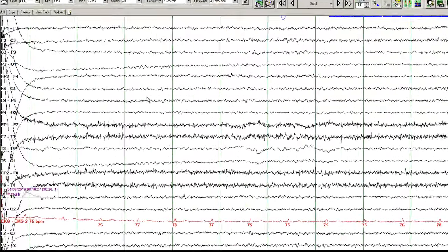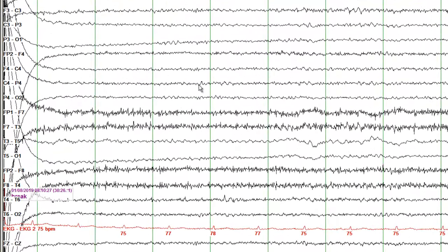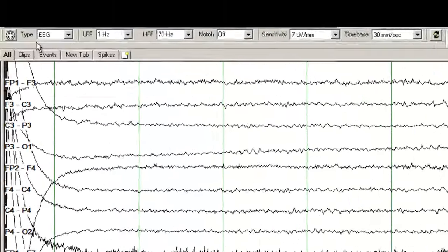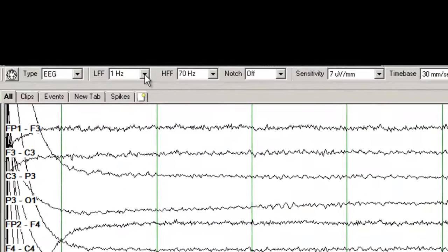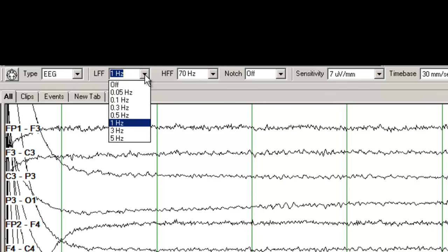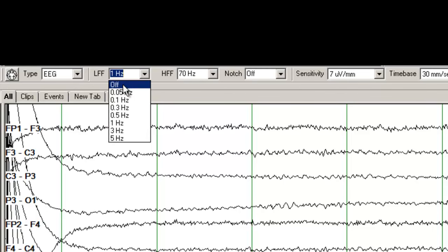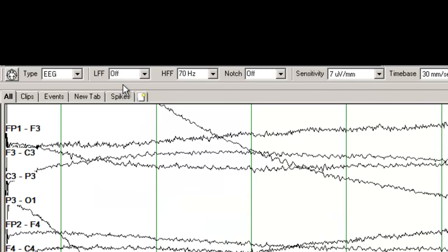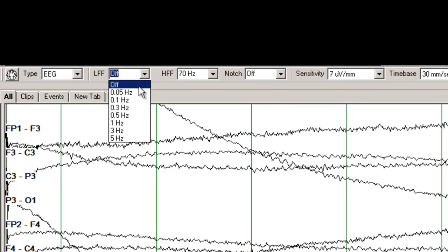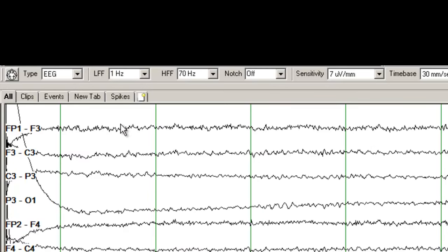These green lines are separated by one second, so you have activity that occurs within that one second. These are the controls up here — these are the different filters you can use. You can turn off the filter and you see that there is a lot of slow activity. You can turn it to 1 Hz and some of the slow activity disappears.